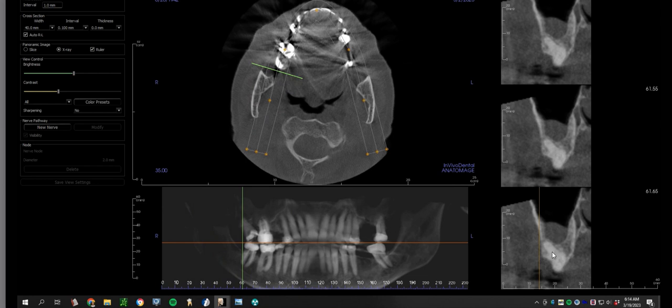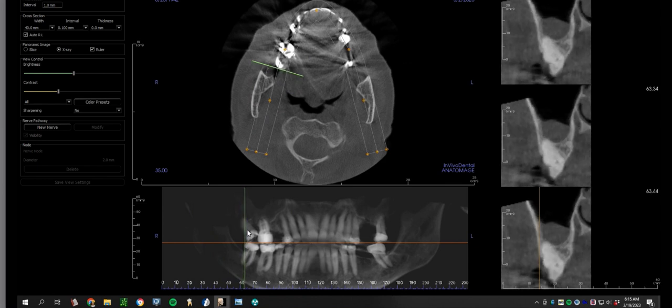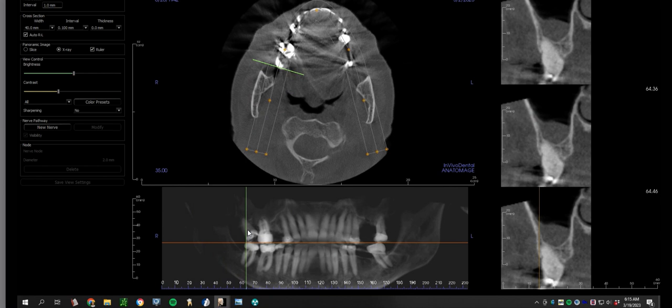As you start to look at these kinds of slices more and more, you're going to gain a sense of what are the things that likely need to be seen by the ENT, and what are the things that are likely to resolve if and when the odontogenic origin has been removed. I'm not putting a whole lot of stock to this right now. It looks rather typical of thickening of the membrane associated with the apex of a tooth.